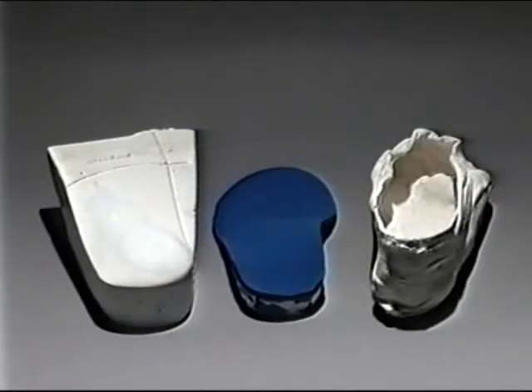Please remember that the quality and effectiveness of any foot orthotic is totally dependent upon the accuracy and precision of the negative cast.